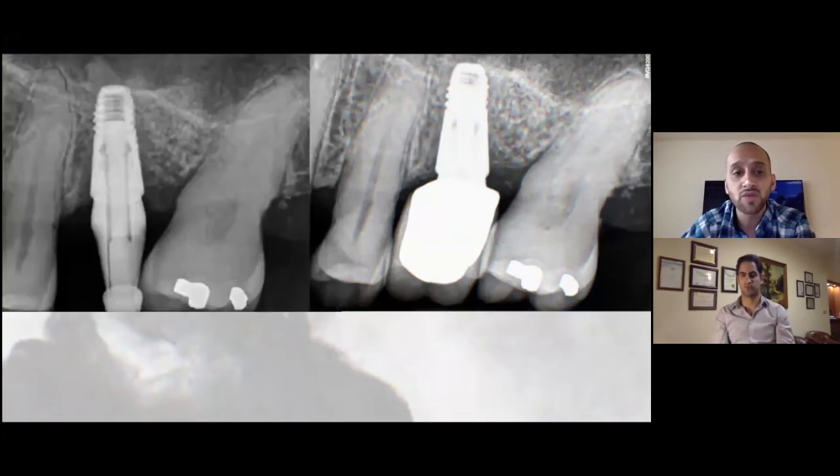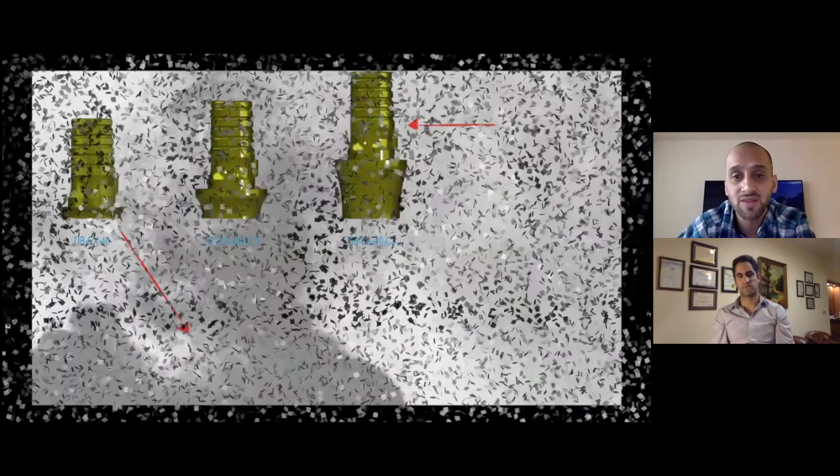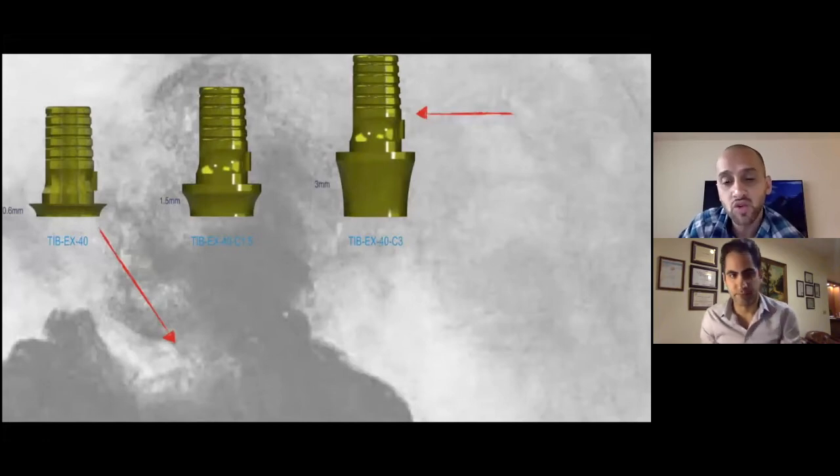So we can start with a situation like this where the implant is placed, and then because the crown didn't have the right profile, you can really lead into some bone loss that probably leads to peri-implantitis, and probably you'd have to remove that implant and place another one, where this could have been avoided if the prosthesis had the right profile. So it is very important to choose the right abutment.